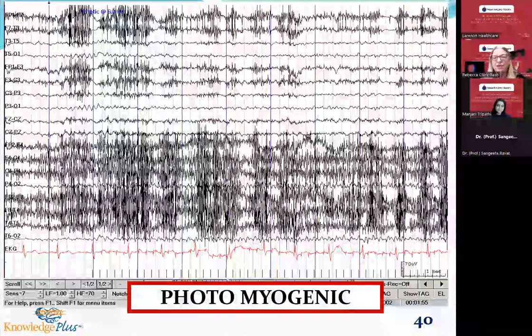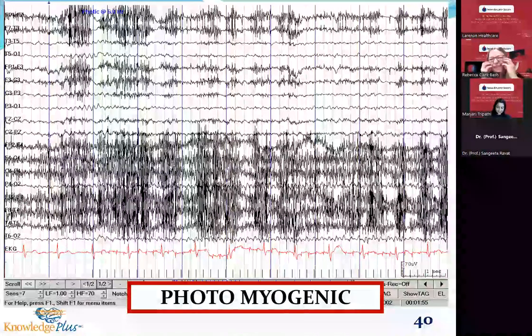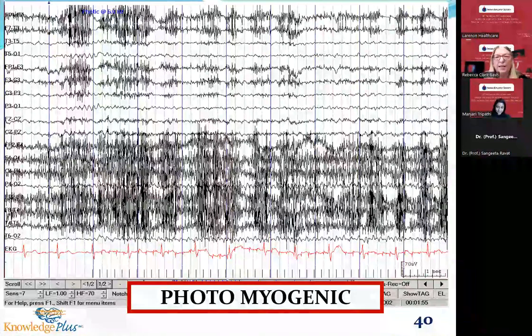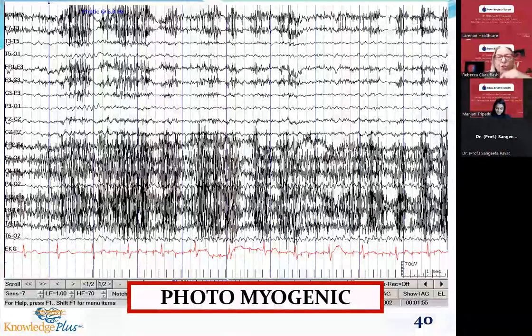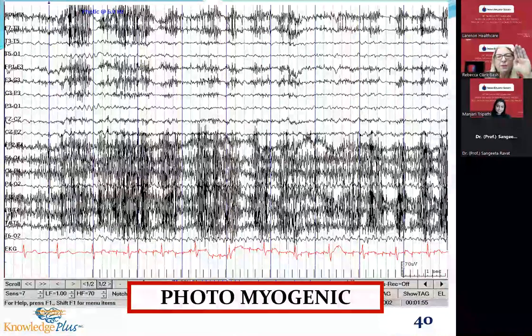This is just a patient very, very sensitive to the light, and their whole face is scrunched up with muscle. What I usually do at this point is I'll say, relax your jaw, Helen. I want you to close your eyes and imagine you're looking down at your feet. Just having their pupil not directed straight up to the light sometimes makes that intense light a little bit easier to tolerate.